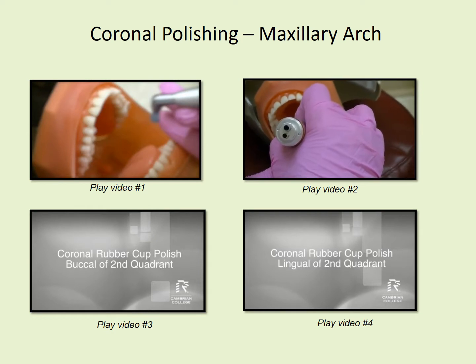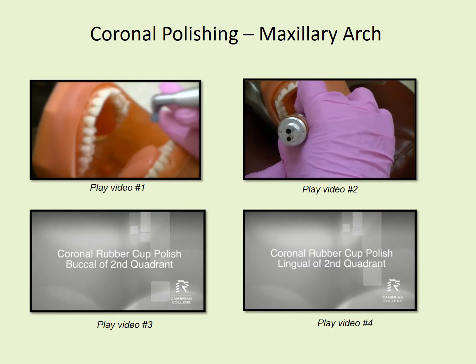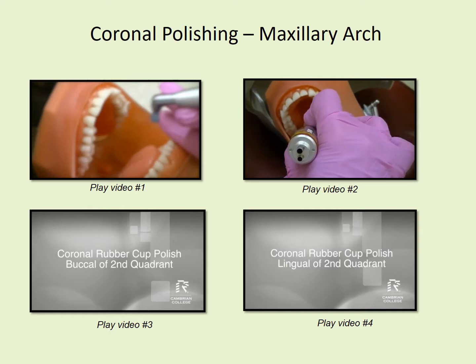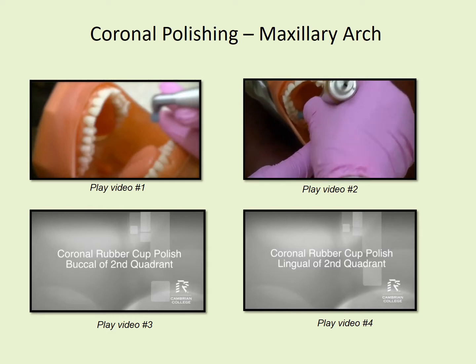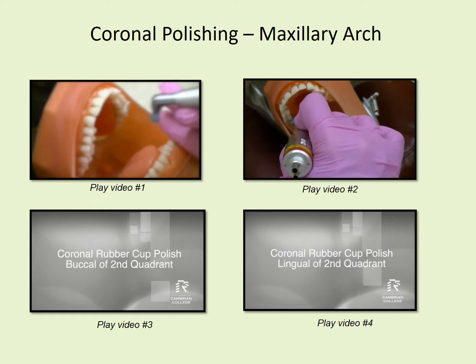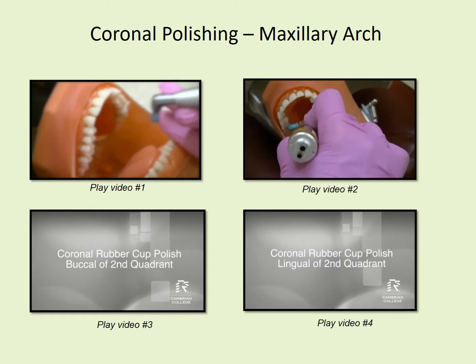You'll sit at 8 o'clock, head towards you, chin up, and begin your technique from the most posterior. Again, work your way anteriorly, all the way to the first premolar.